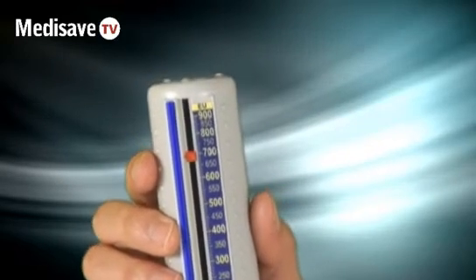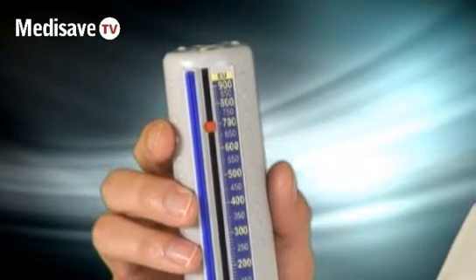It comes with a recording chart — a two-week recording chart — which you can record and then put your results back in occupational health or for asthma, etc.